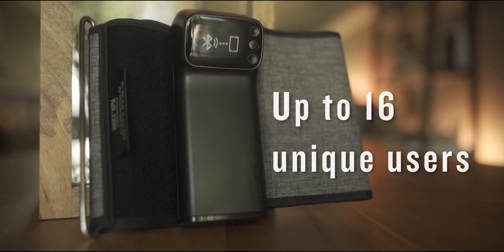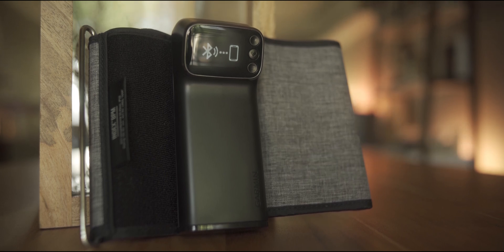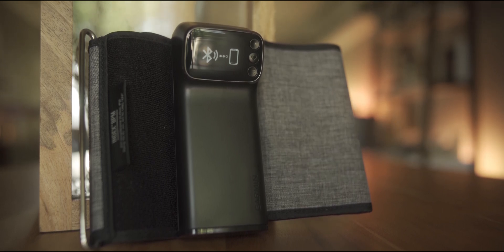Up to 16 unique users have the option to sync their results from a single Indexed BPM monitor to their own Garmin Connect account and view their own stats.